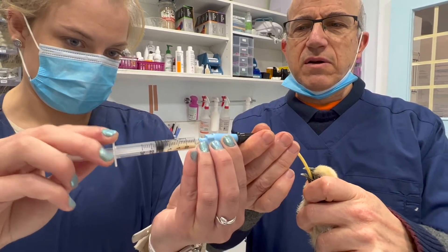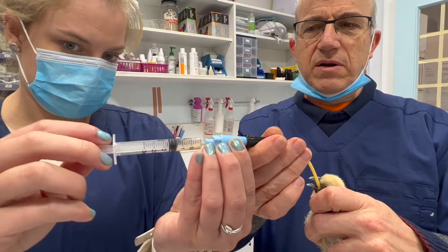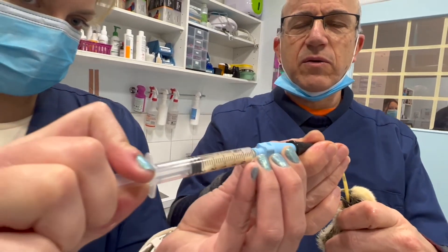Slow down, slow down. Let go, push in. Push in a little bit, just a little bit. Okay, stop. Go again. You're being a very good little patient. Right, take it off.